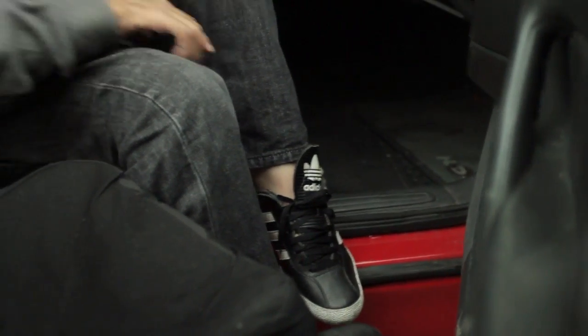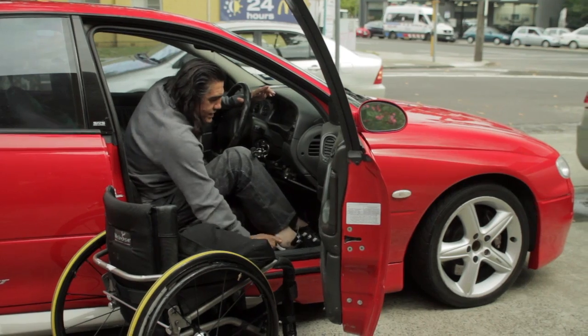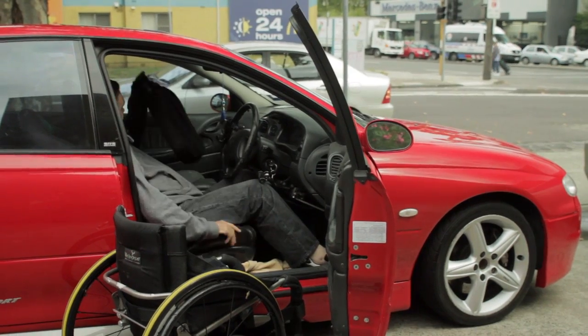When I'm getting in, I leave both my feet on the foot plate. Some people put their legs inside the car first, but I like to leave it outside. So once I get my legs inside, it's just a matter of pulling the chair apart and getting it across onto the passenger seat.